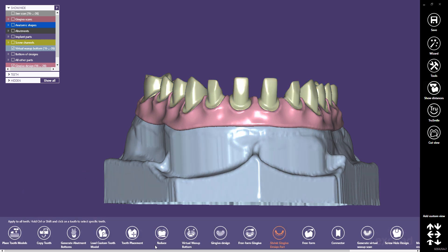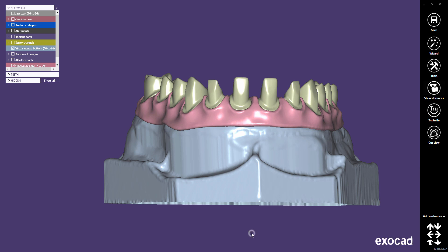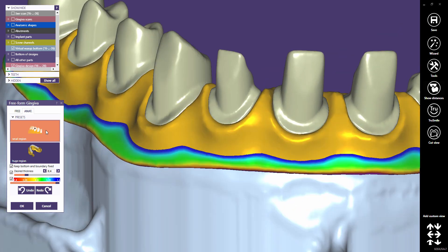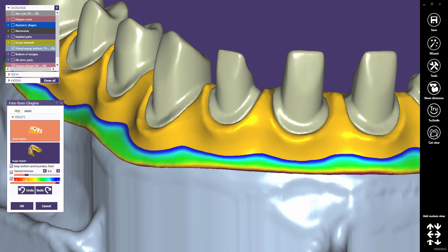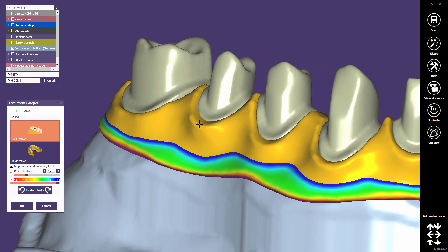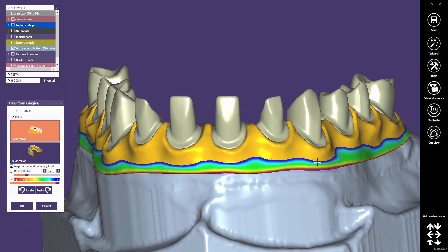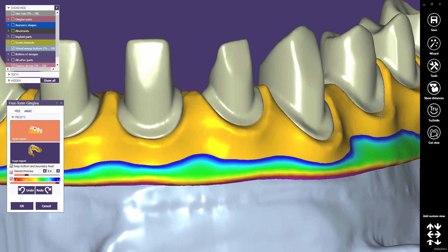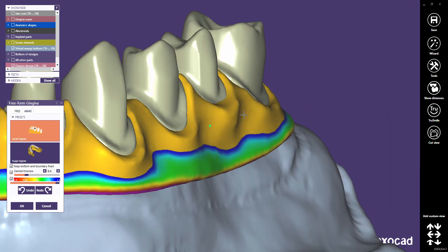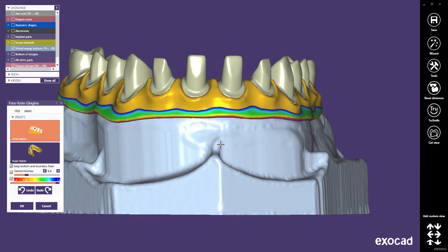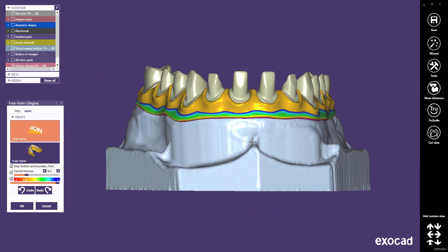Stay in Expert mode and choose Free-form Gingiva. Try to avoid overlapping the gingiva and thimble crown borders. Click OK to close this dialog.